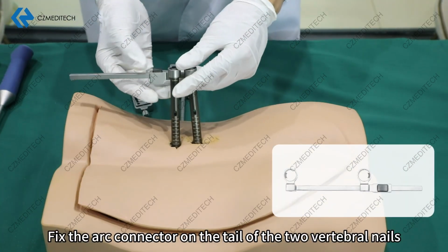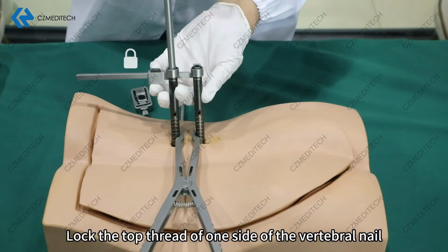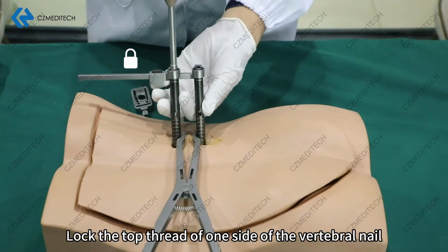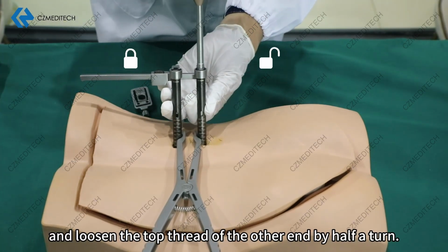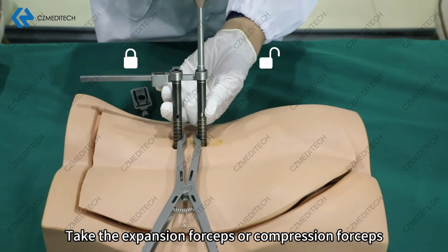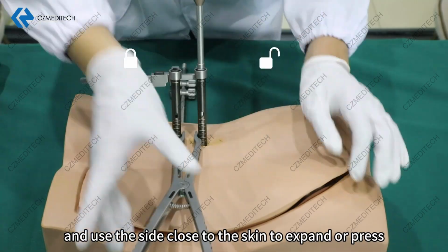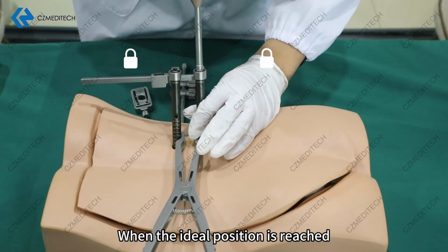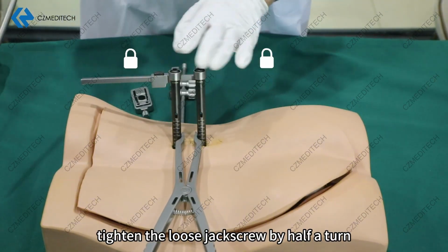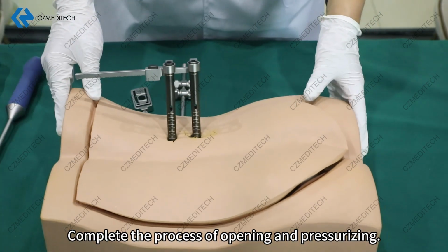Fix the arc connector on the tail of the 2 vertebral nails that need to be stretched. Lock the top thread of one side of the vertebral nail and loosen the top thread of the other end by half a turn. Take the expansion forceps or compression forceps and use the side close to the skin to expand or press between the sleeves of the 2 vertebral nails. When the ideal position is reached, tighten the loose jack screw by half a turn. Complete the process of opening and pressurizing.